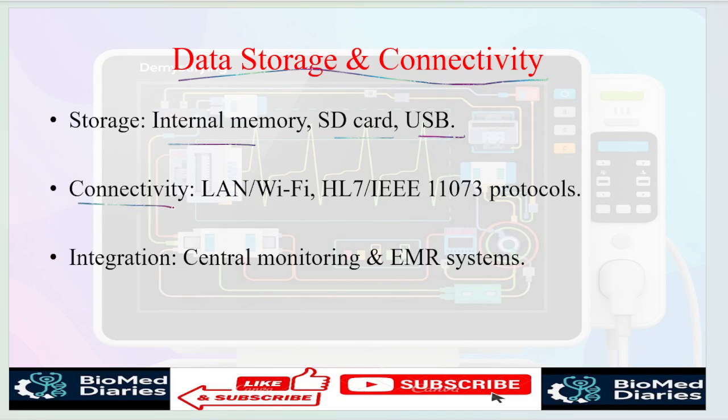For connectivity, we can use the patient monitor as a central monitoring system, in which we can use LAN, Wi-Fi or HL7 protocols for transfer of data from the patient monitor to the central monitoring system and EMR system, electronic medical records.